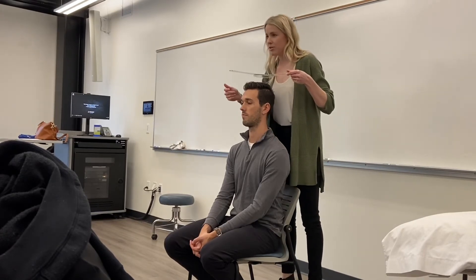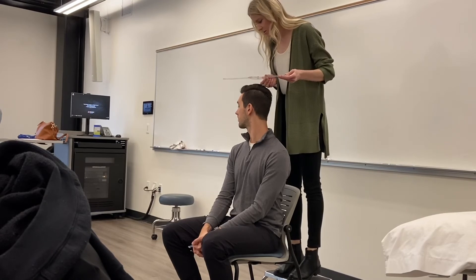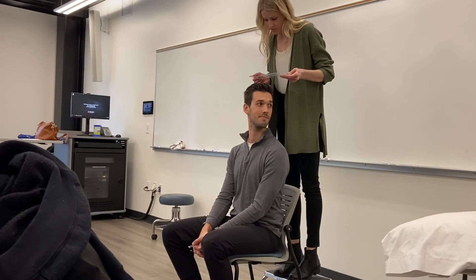Your stationary arm is going to be parallel to an imaginary line between the acromial processes. Your moving arm is going to be with the tip of the nose. Ask your patient to look all the way to one side — go to the right. He gets to 65 degrees. Then the other side — he gets to 75. Normal is 60 to 70 degrees.